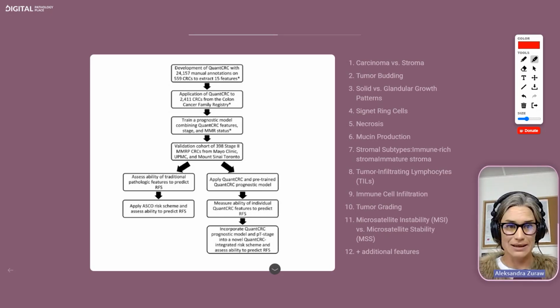But basically, when we can give examples, everything that's counting, if I was in charge of anything, and I'm not doing diagnostics at all, but if I was in charge of any of those scorings where people have to count something or estimate the percentage of something, I would scrap it and mandate this to be done with image analysis. Because from the literature that I analyzed, the difference that a human eye can physiologically perceive, for example, between numbers of eosinophils, or estimates, is 25% before you start seeing a difference.